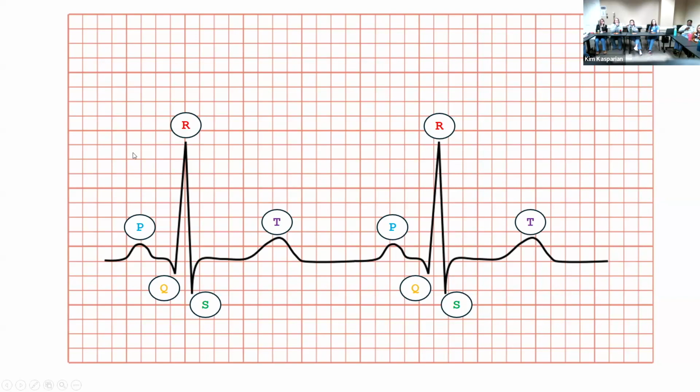So what's happening during the QRS? Ventricular depolarization, right? You have it going down the His-Purkinje system, the bundle of His, and then back up. That's why you have that negative deflection, because you're going the opposite direction. And then the T wave, finally. Repolarization of the ventricle. Got it.